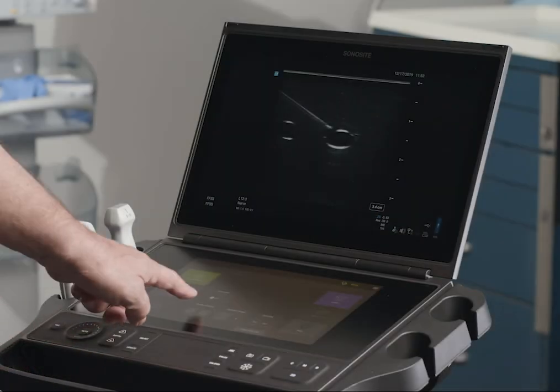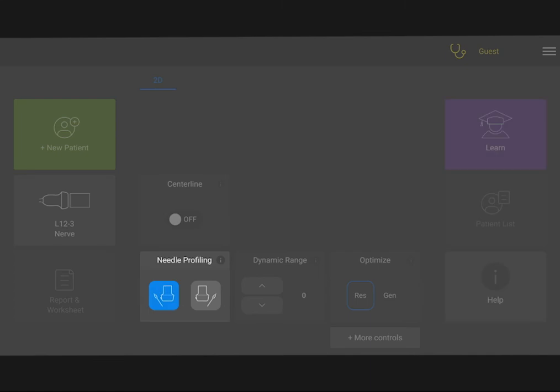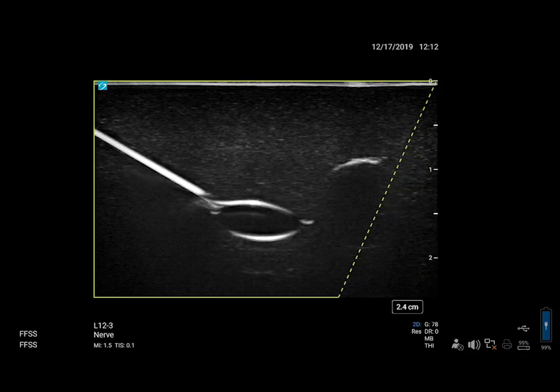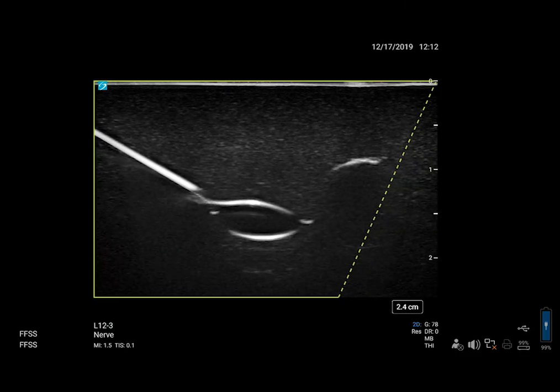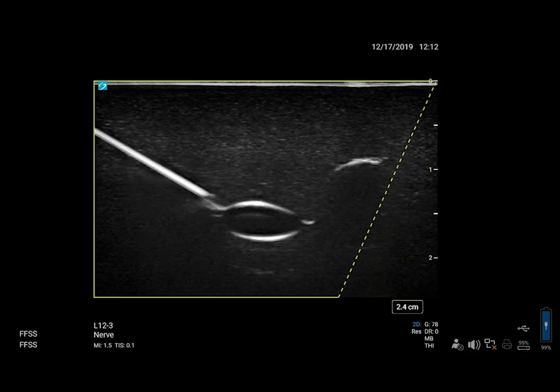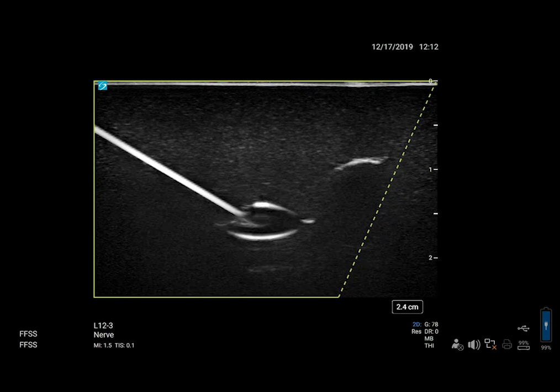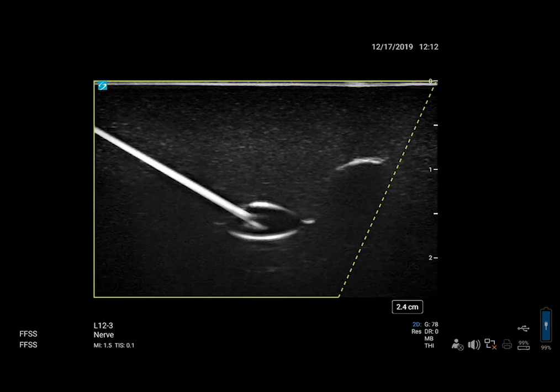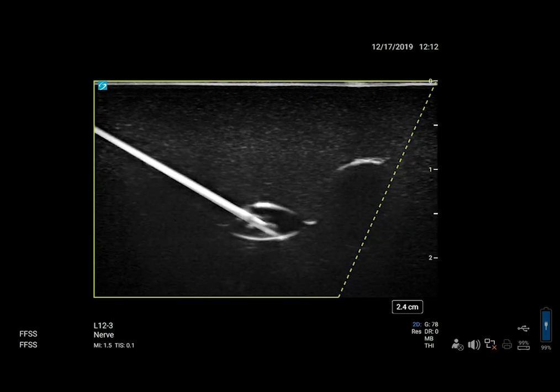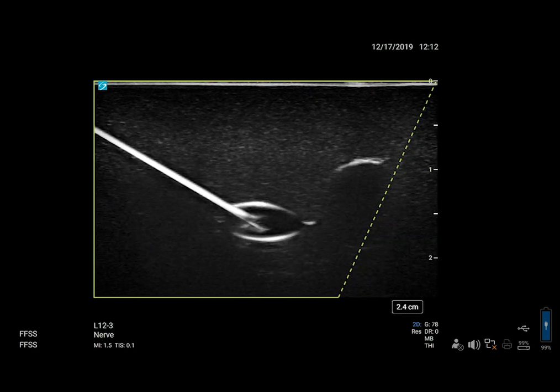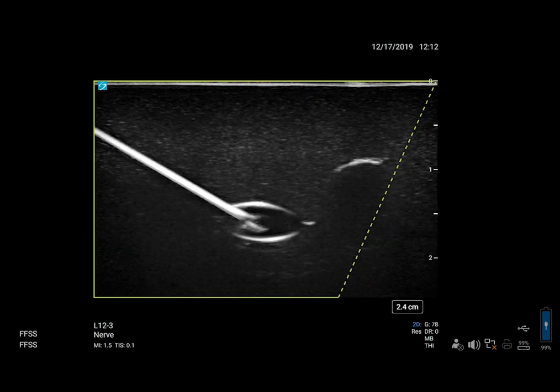If you are performing a needle procedure, take a look at Needle Profiling. Needle Profiling can help visualize the needle during these procedures. You will still need to use movement and fluid injection to locate the needle tip.